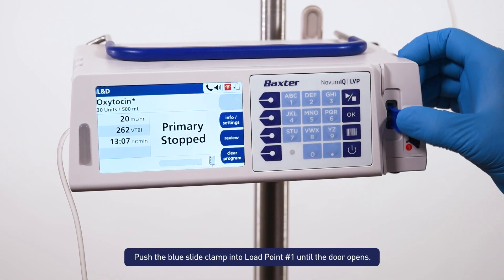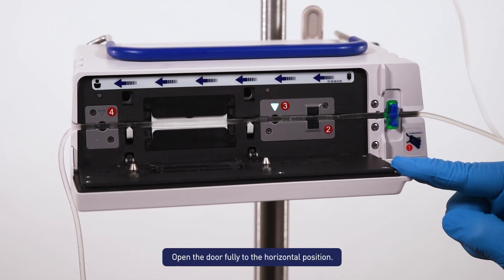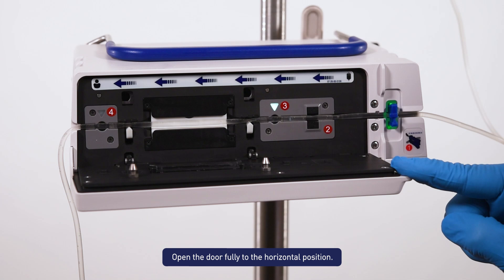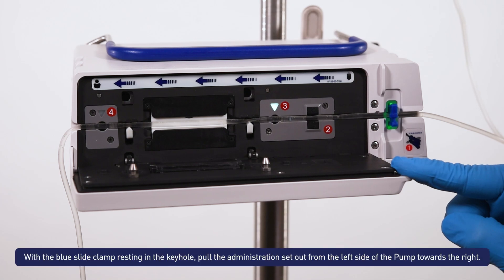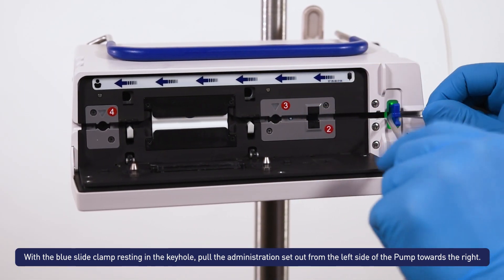Push the blue slide clamp into load point number 1 until the door opens. Open the door fully to the horizontal position. With the blue slide clamp resting in the keyhole, pull the administration set out from the left side of the pump towards the right.